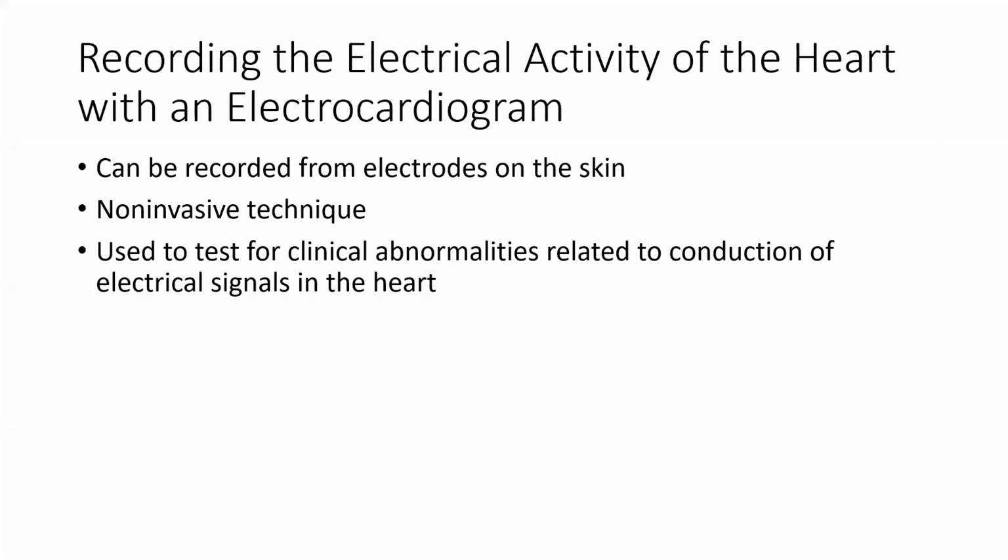And we pick up the electrical activity of the heart and some of the directions, which we call leads, of that electrical activity. And we can measure that through the skin. It's a very non-invasive technique. It takes all of a couple minutes, 5 or 10 minutes or so. And we can get that very valuable information about the heart rate and the heart rhythm.